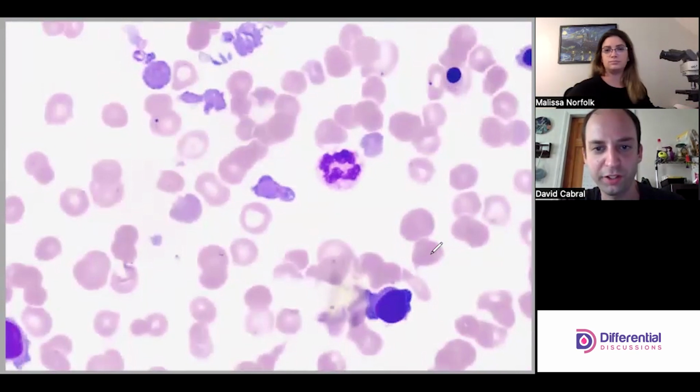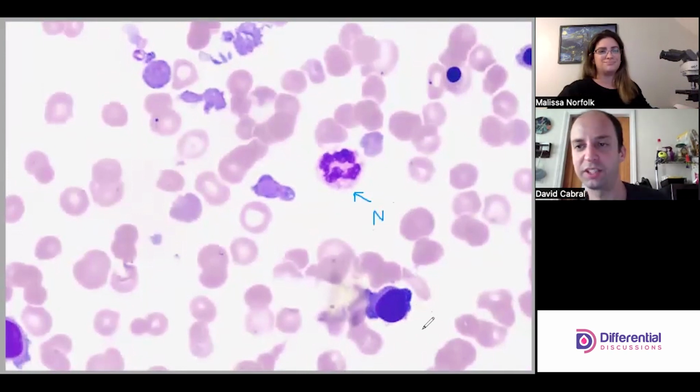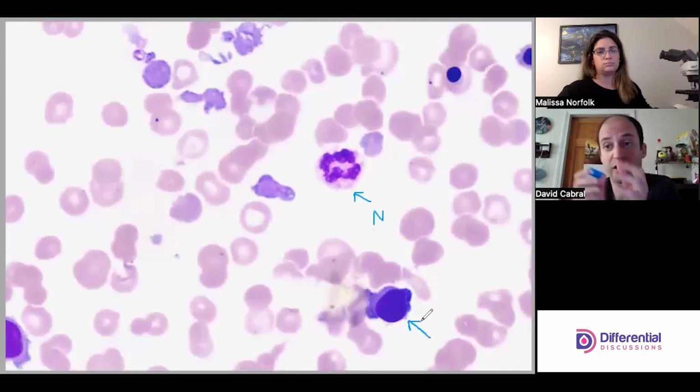We've got a neutrophil in the center-ish of the field. And then, in the bottom right, okay? I have the hindsight of the previous field, and I know this slide. I've looked at this slide countless times, but you should be in that mindset of abnormal stuff. This is not a lymphocyte. Even a normal resting lymph that has a dark clumped nucleus, I can still see the detail. The detail is gone from this.